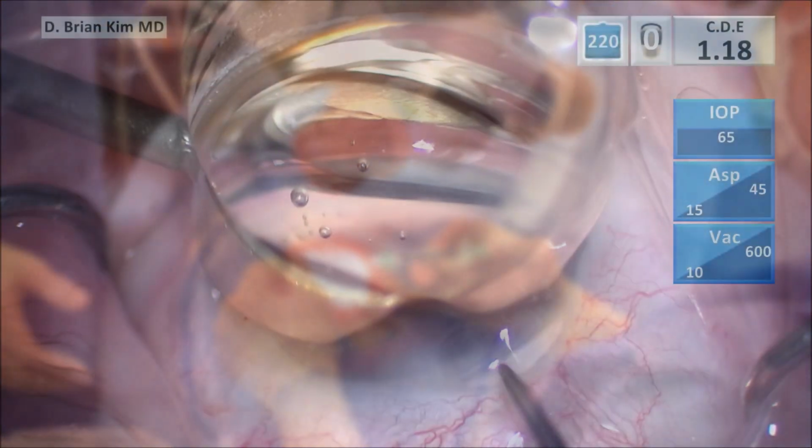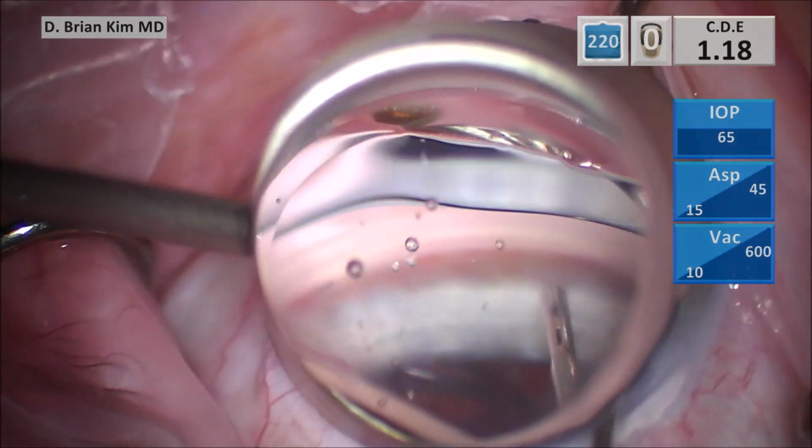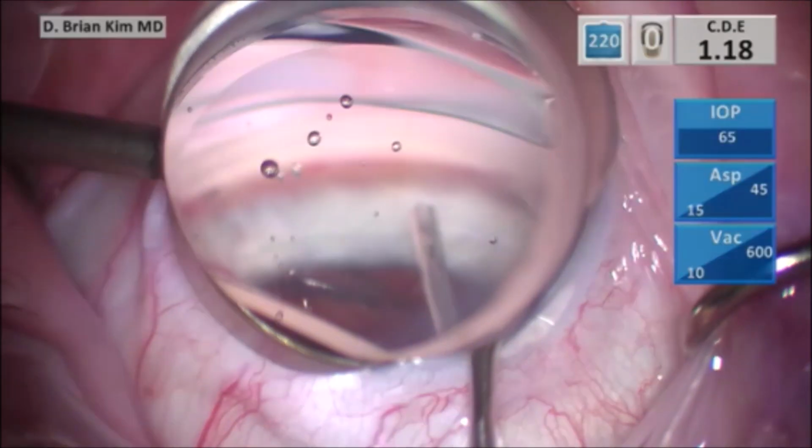And so this is a key. The reason why people have trouble getting wide separation between the first and second stent is because they try to make a translational movement of the device. And so you can see if you just try to slide the device over towards the right, thinking you're going to create more space between the first and second stent, the problem is you're going to abut against the right edge of the incision. So again, when you're trying to move the device over to the right, if you make a translational movement, meaning you're just shifting the entire device over to the right, the device will encounter the right side of the incision and you're going to be hitting a wall and it's going to cause corneal stria.